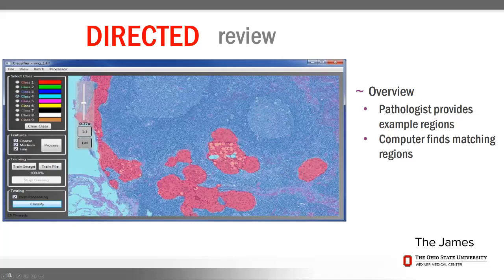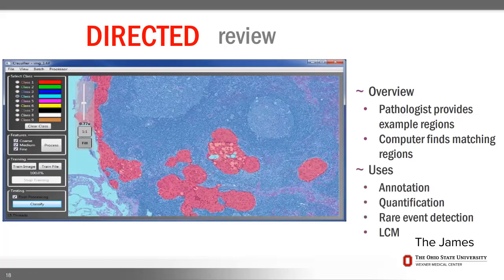You can also do disease surveillance. You can also see disease progression and extent of disease in lymph nodes. So today, this is all possible with AI. And so if you're a pathologist who has 100 lymph nodes to review, wouldn't it be nice to have a tool like this, which will actually show you all the areas where the computer thinks it's cancer?